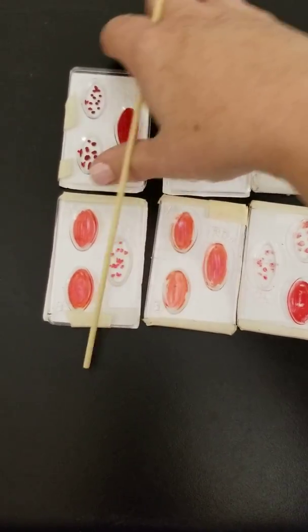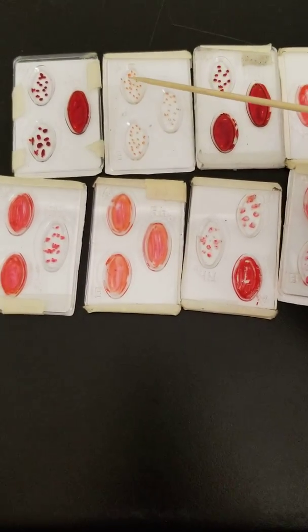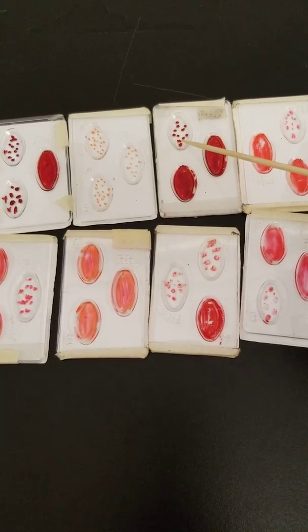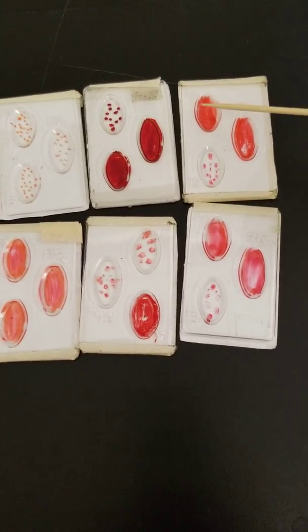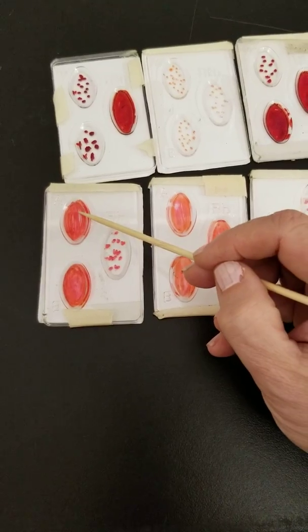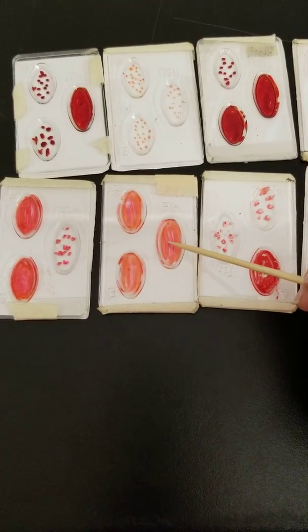And not on the ones on the test, but the ones that we're practicing with in class, you can see written on the back, it says AB negative, okay? Here we have clumping, clumping, and clumping. So this would be AB positive. This one, the A is clumping, but the B and the RH are not, so this would be A negative. Here we have, whoops, this one's upside down, sorry. We have no clumping in A, we have clumping in B, and no clumping in RH, so this would be B negative. Over here, neither A nor B is clumping, but the RH factor is, so this would be O positive. This one would be O negative.